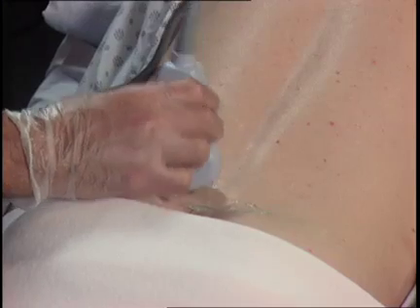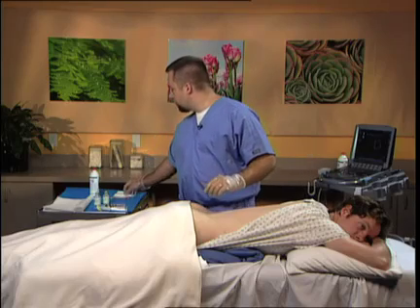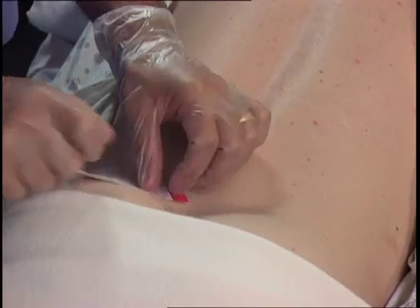At this point, the probe is removed. I utilize the 4x4s to clean the area. And a Band-Aid is placed over the wound. This successfully completes the ultrasonographic facilitation of a sacroiliac joint injection.